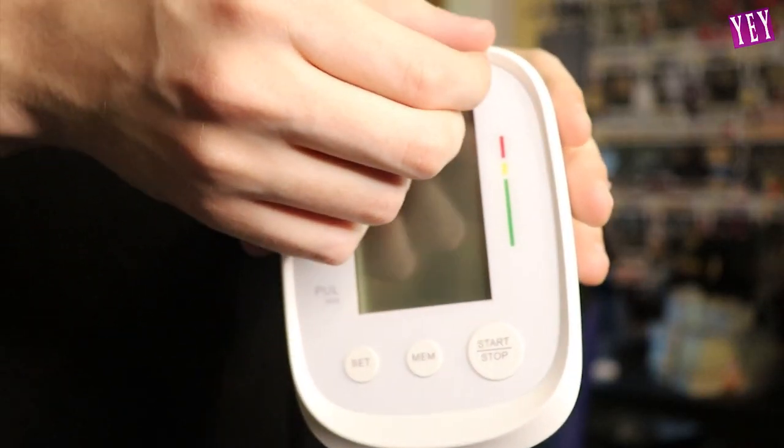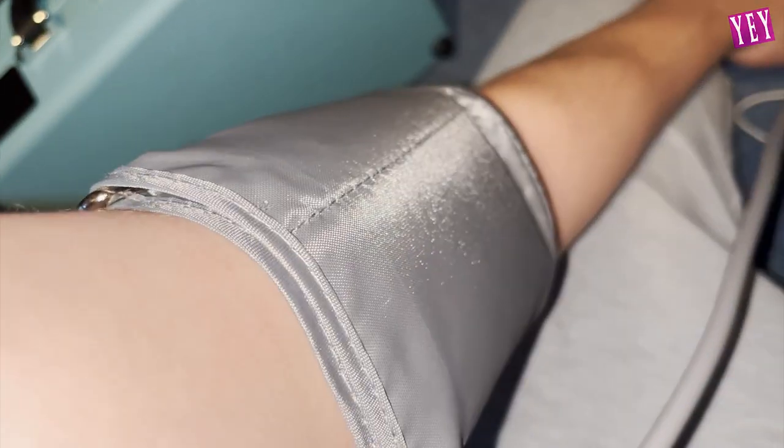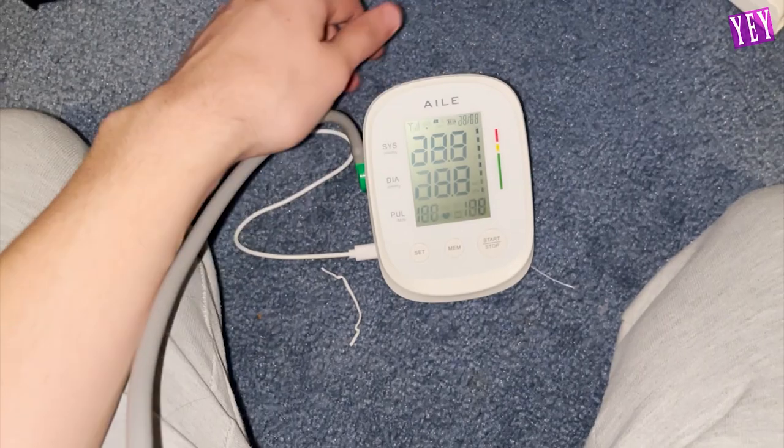Oh my God, guys, look — it has our favorite. All right. The next thing to do is to test if this thing will do our blood pressure. You guys are making my blood pressure go up right now — I'll tell you that much, I can feel it in my bones. So I have the device strapped up and ready and we're going to check my blood pressure. Let's do this.